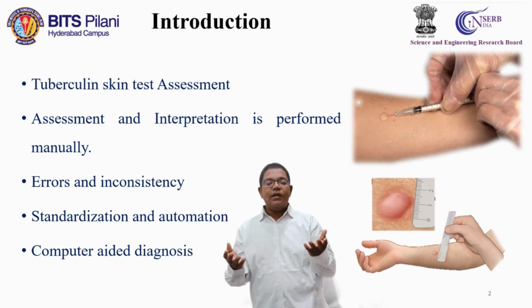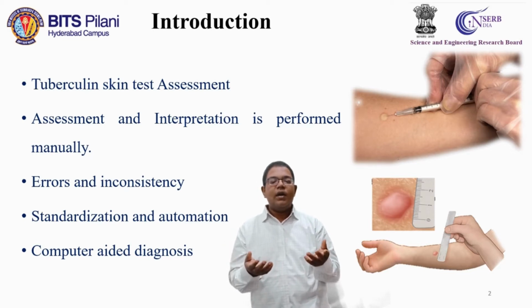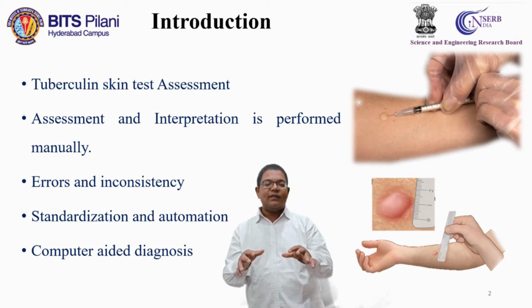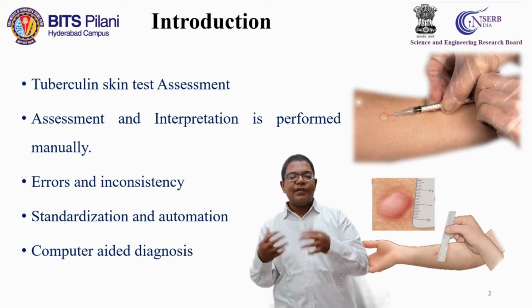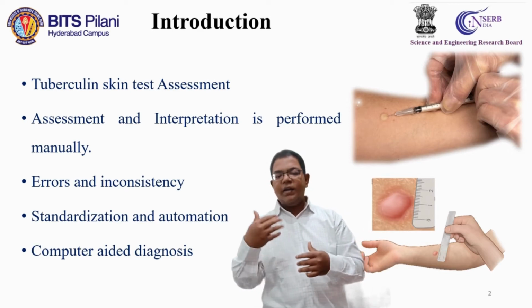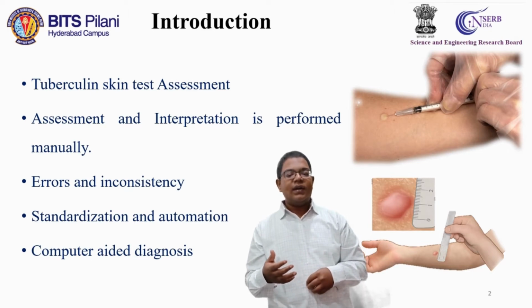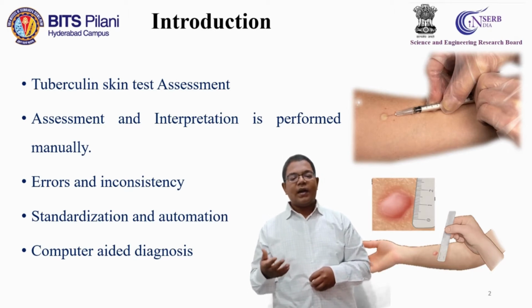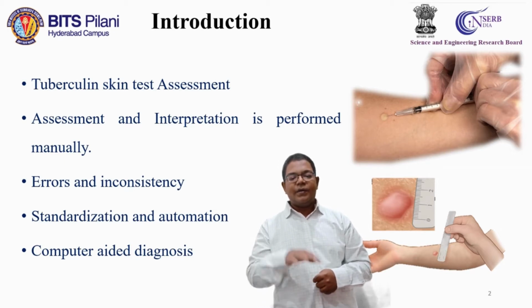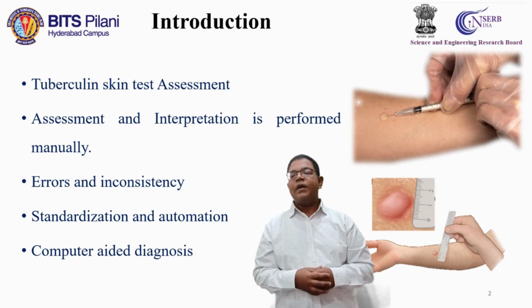So our initiative of developing this CASTA app not only tries to minimize the inconsistencies involved in the observations of this test, but also tries to improve clinician and patient interaction, and to enhance data handling by keeping track of historical data, so that the clinician and the patients might use the data in future.